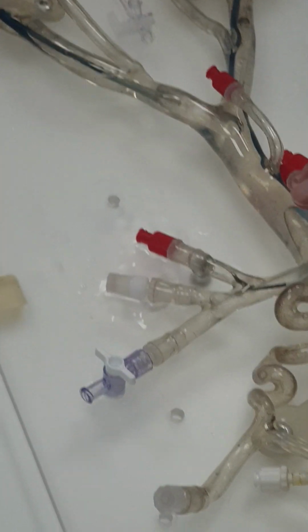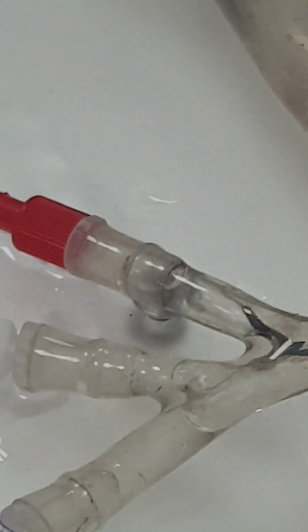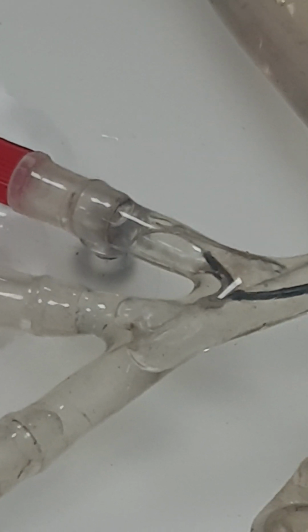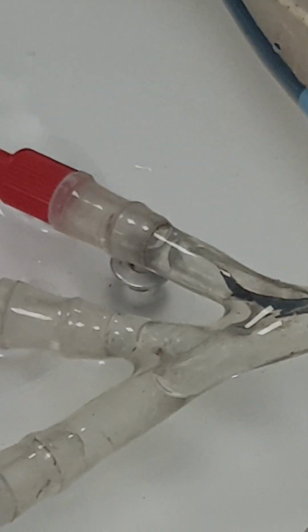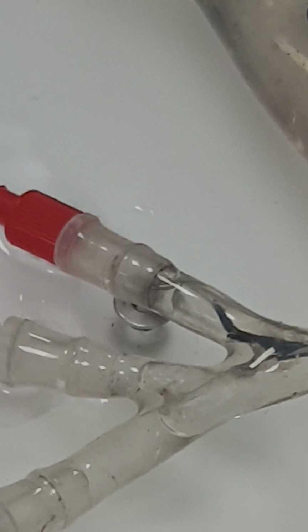So what is your target? Not that fast. You have to allow coiling. So you have to back it. Slowly deploy and see. See, this is kicking back. This is not okay. If you see something like this, you can use it as a wire and readjust. So push your catheter over the coil and push again slowly and see. See, this is the shape you want to achieve.